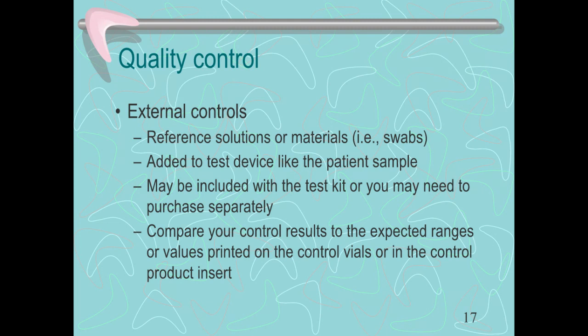Compare your control results with the expected ranges, and then either print the values if you can print them. Otherwise, be sure you're documenting them regularly. And when you do them, the time, the date, and what the results are.